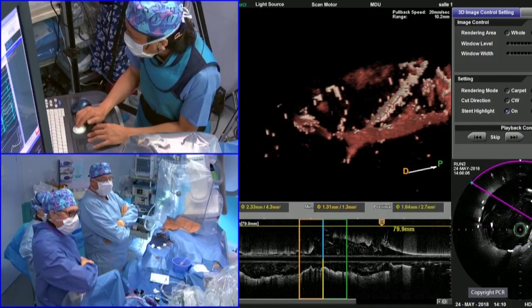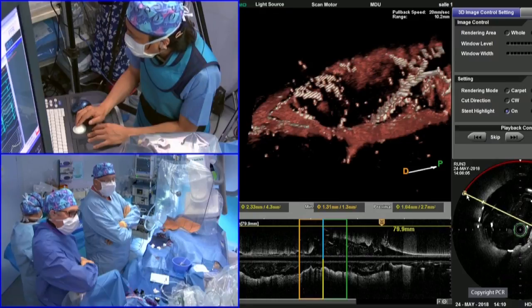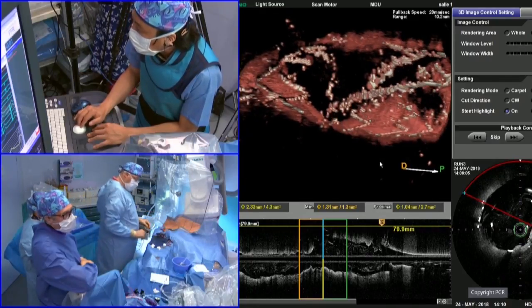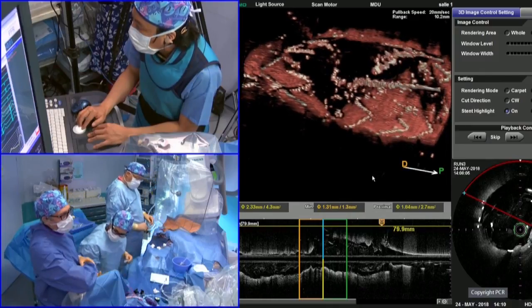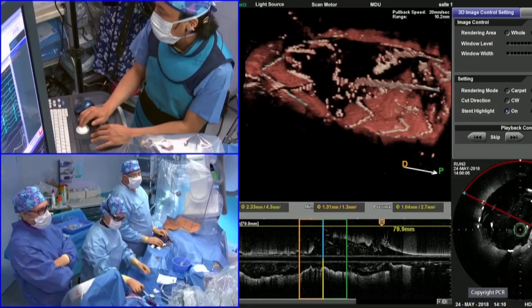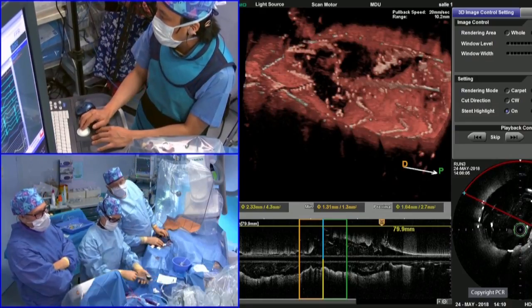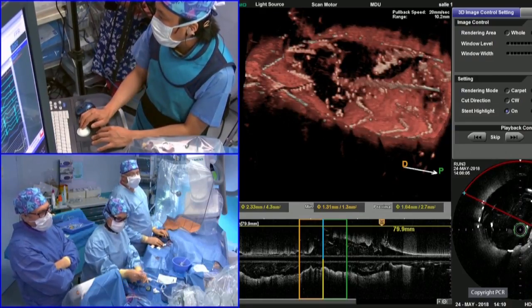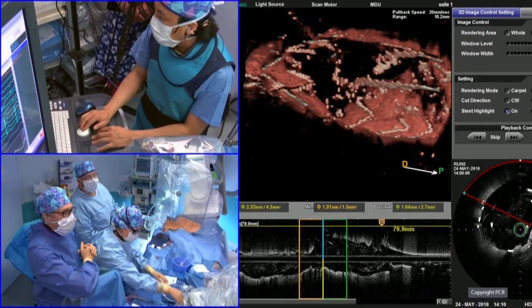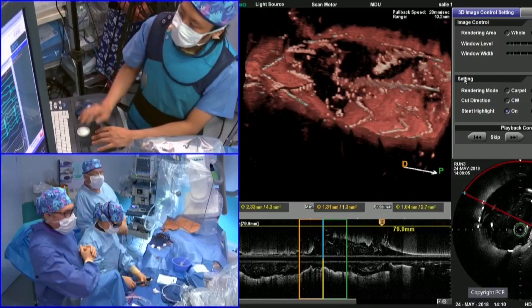And this is one of the main limitations of side POT, because when you do POT, side branch inflation, then second POT, it's very difficult to be precise and really put the distal marker in order not to compromise the result. But even if you are extremely precise, you will never be able to put the carina in the center. So these are advantages and disadvantages. So we need to collect more data.